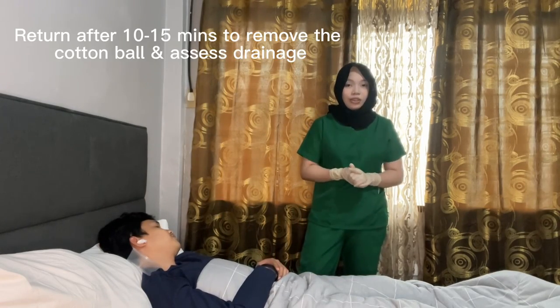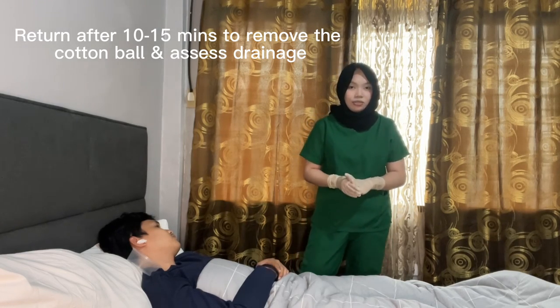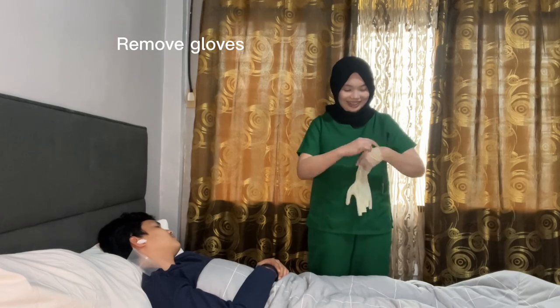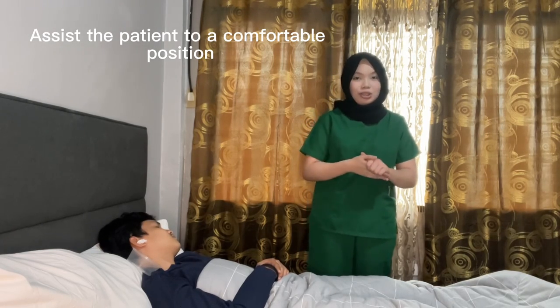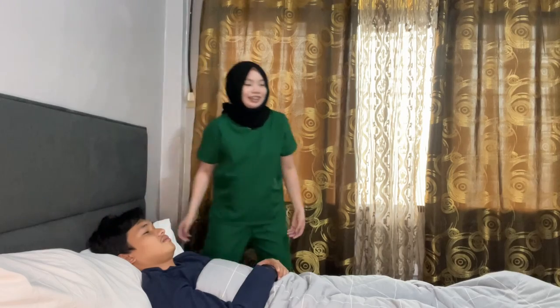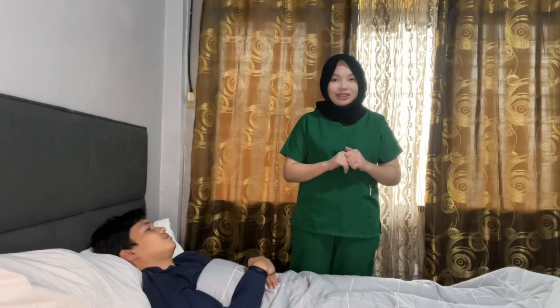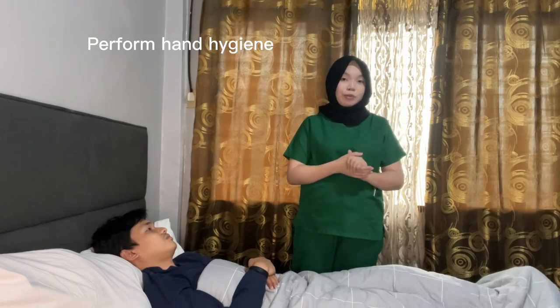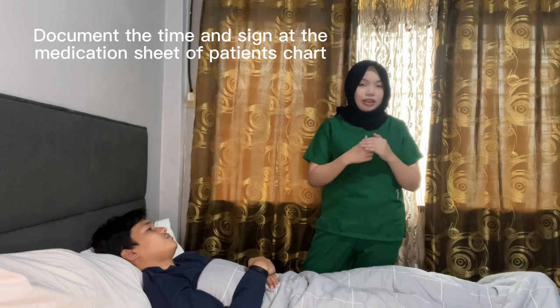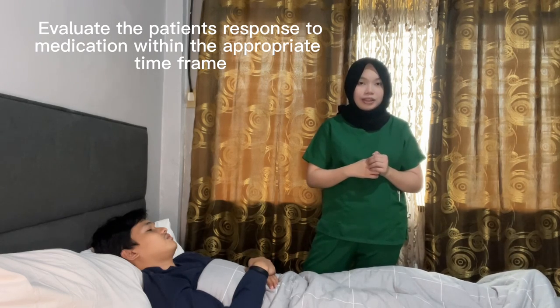After placing the cotton ball, return after 10 to 15 minutes to remove the cotton ball and any excess drainage. Remove the gloves and assist the patient to a comfortable position. Remove the additional PPE and perform hand hygiene. Document the time and the site of the medication in the patient's record. Evaluate the patient's response to the medication within the appropriate time frame.